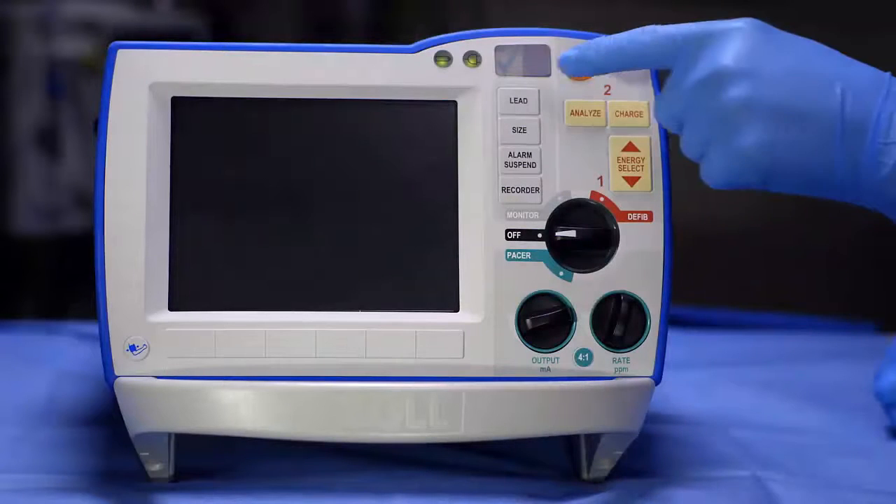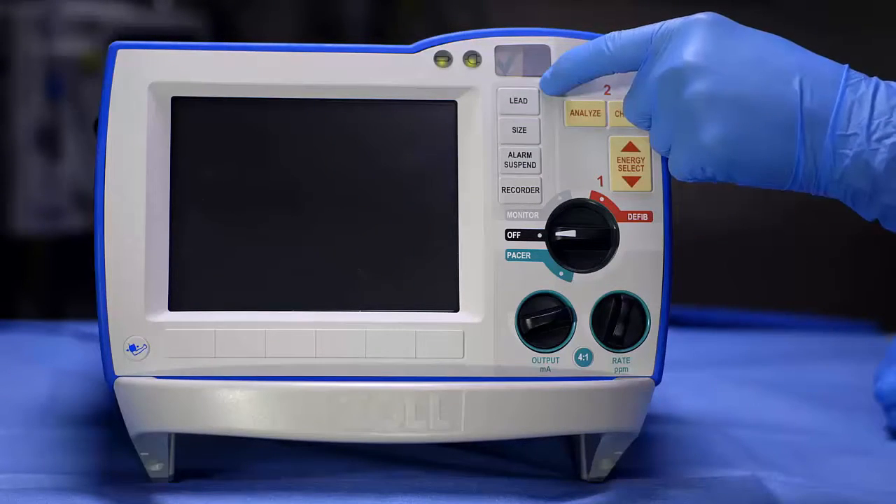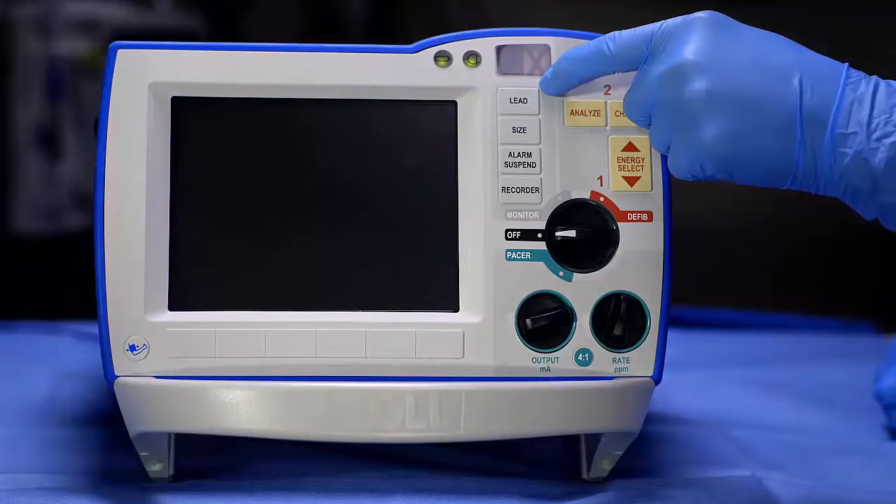Before using, verify that the R-series defibrillator is ready for use by noting the green checkmark on the front panel. If a red X is present, one person should attempt to deliver therapy while another runs to get a defibrillator with a green checkmark.